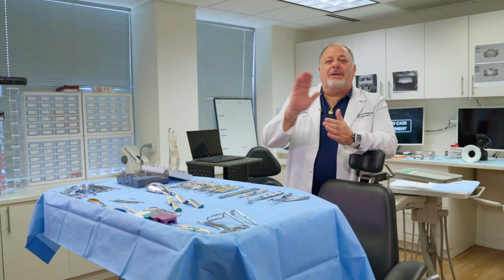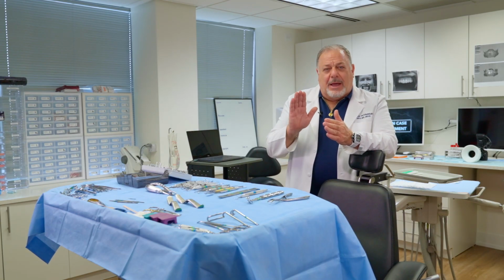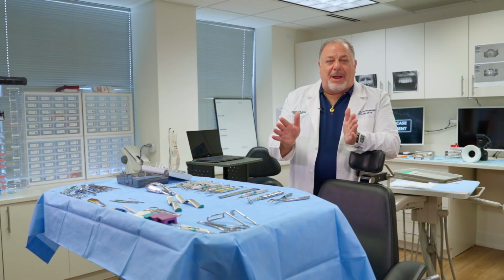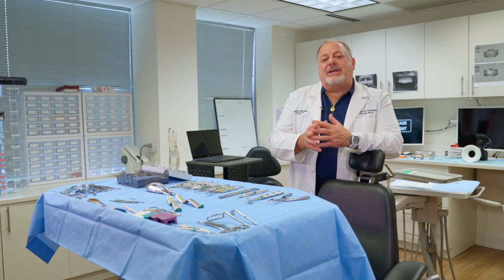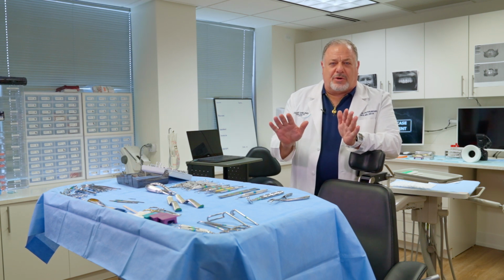Now, enter into the aspect of zirconia as a material. You do have some benefits with the zirconia implants for the replacement of titanium implants, especially in the aesthetic zone. As a general rule in our practice now, anytime I'm doing revision case treatment on any titanium implant, we're removing and replacing, it's all done with zirconia implants.